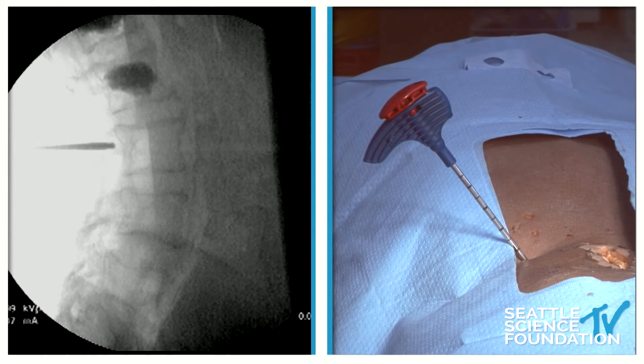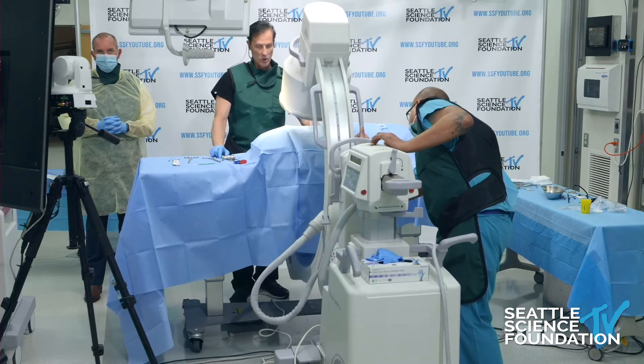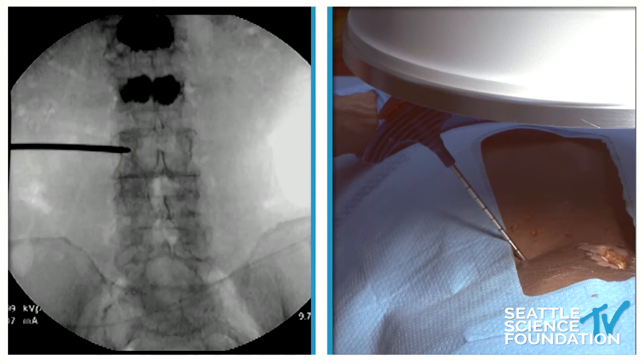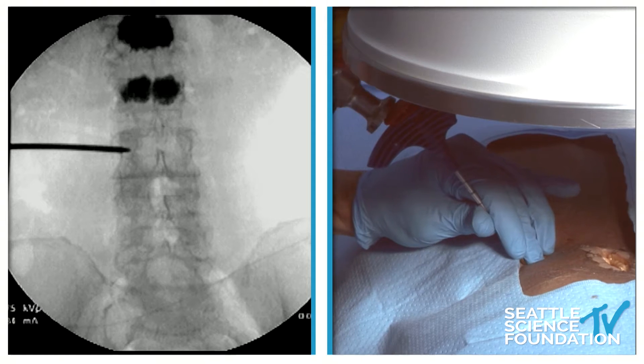I don't really like to drive it very far, even though I have a far safety zone. I don't like to violate the medial wall until we're in the posterior portion of the vertebral body — exactly the same rule as a vertebral augmentation. We can see we're approaching the medial wall, but not through it.